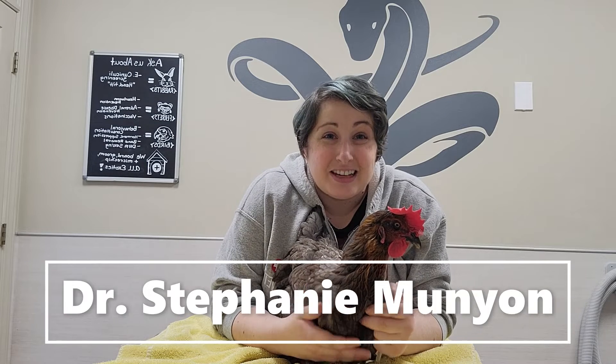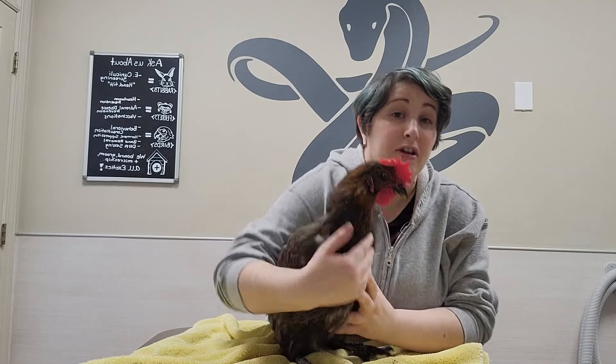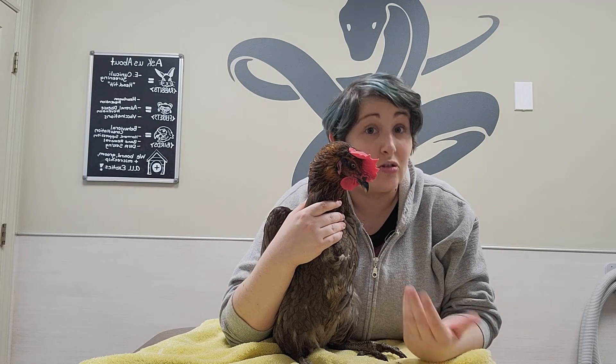Hi, this is Dr. Munyon with Exotic Avian Care, and Ruth Bader Hensberg and I are going to show you how to do an injection on a chicken. The most common reasons we have to do this is either for administering an antibiotic, something to help with heavy metal toxicity, or pain medication.